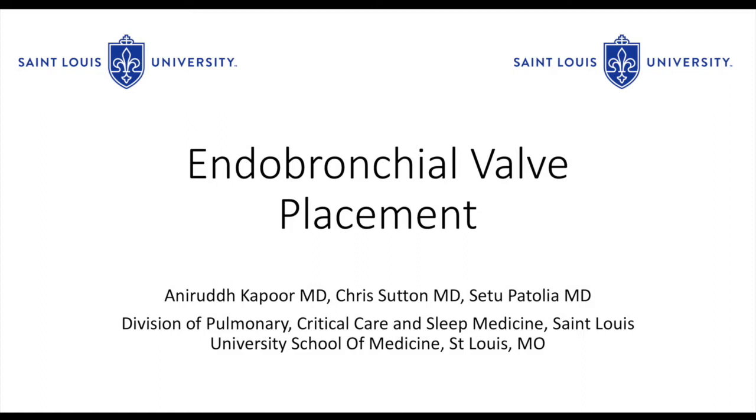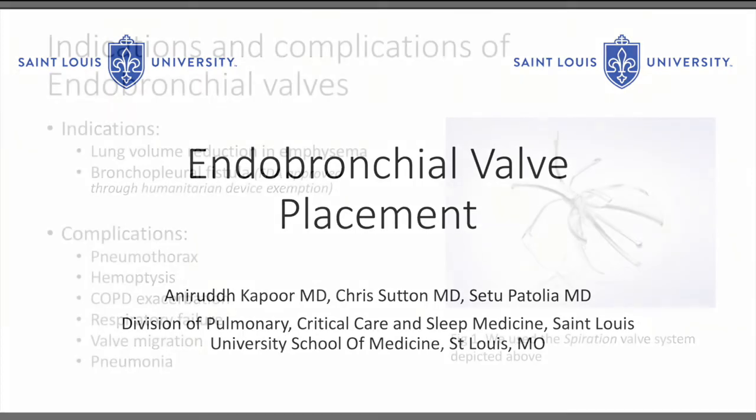Louis University. Today we will be describing the process of placing endobronchial valves for the treatment of a bronchopleural fistula.